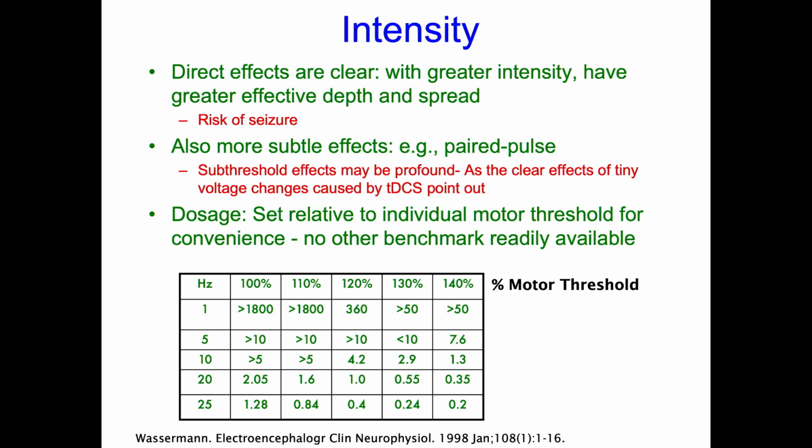However, what we found early on is that the higher the intensity, the more chance of something like a seizure happening. And there have been actual studies that have shown, given a frequency that you use, higher frequencies also lead to seizures. And this is the intensity based on the motor threshold I just mentioned before. So if I stimulate at 10 hertz, the trains of TMS, how long you can stimulate before you risk seizure, those numbers go down with increasing intensity.